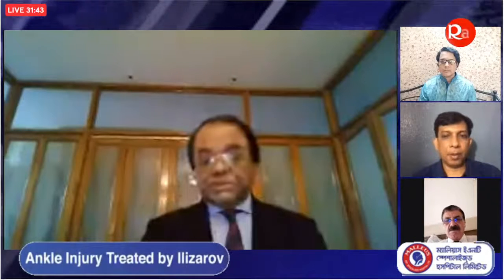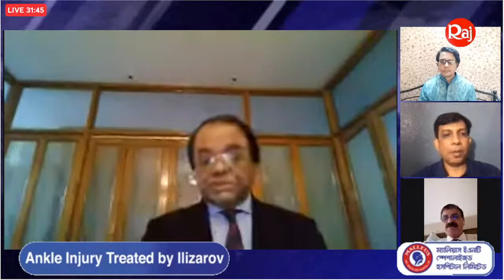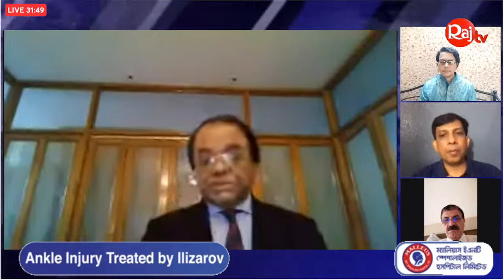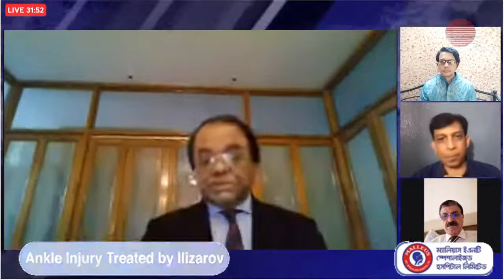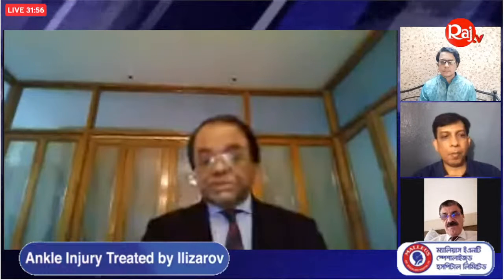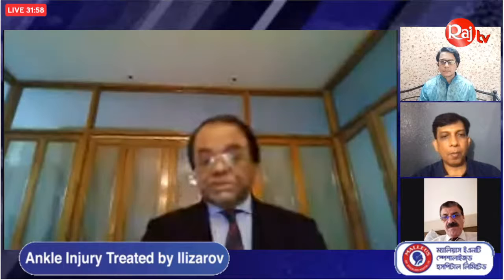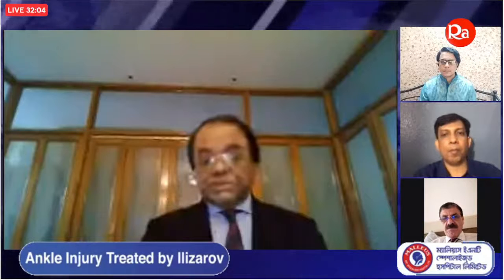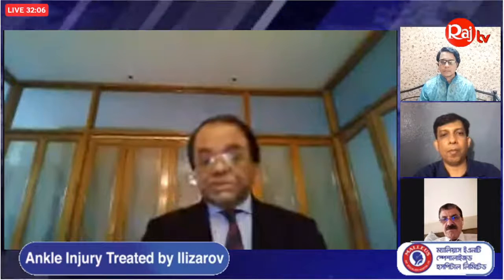Ilizarov surgery post-op protocol is very important. Stable fixation is mandatory for the Ilizarov apparatus, and you must check every day. An Ilizarov surgeon must have patience. Check the proper way, whether your frame is stable, wires are stable, tightened or not. You must check every day, all the time.